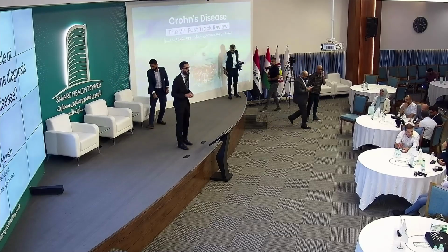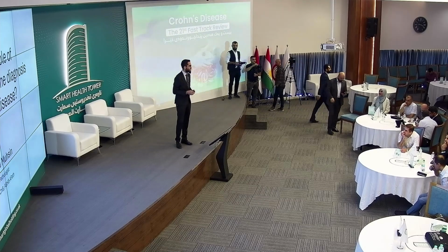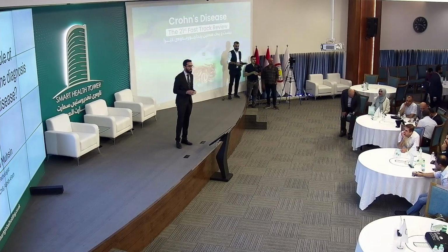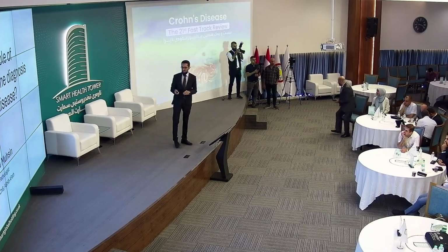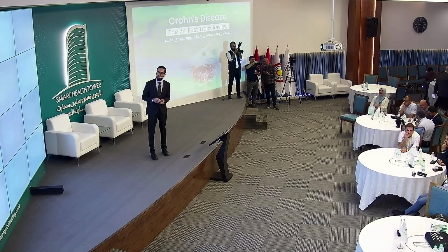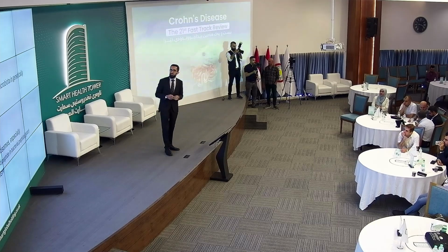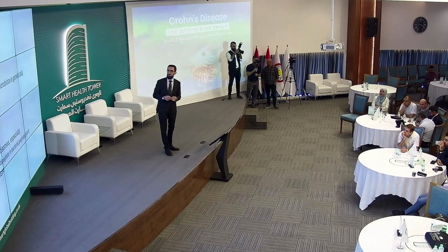I'm a pathologist, and I'll be talking about the role of histopathology in the diagnosis of Crohn's disease and differentiating it from its mimics, mostly the histologic mimics. So the bulk of my talk will be about the morphology of Crohn's disease. Dr. Sivan thankfully already talked about the pathogenesis, so I don't need to go into details.